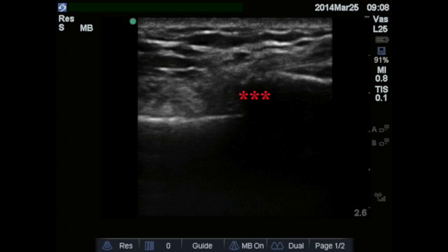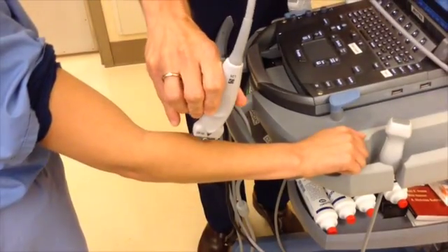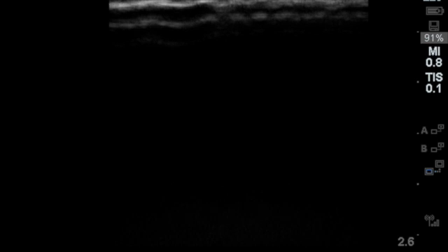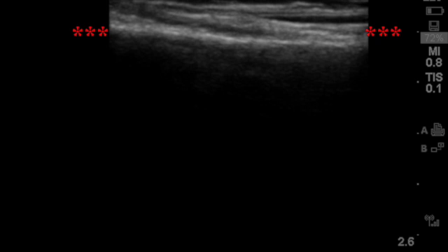Notice the very distinct disruption in the bone. To perform the ultrasound, start at a distance from the fracture. Find the cortex of the bone, which is bright white and strongly echogenic with shadowing behind it.